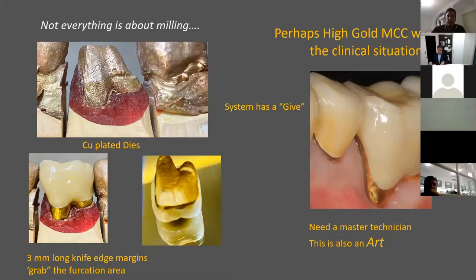Because subgingivally, you can flick off the zinc phosphate cement, it has a give, and that's the most important thing I feel as a clinician. It gives me that warm, fuzzy feeling when I'm restoring these teeth, because you can see the surface of the occlusion is flat. Which answers your question.